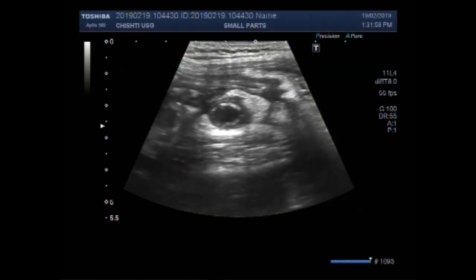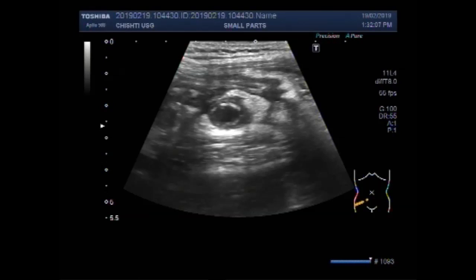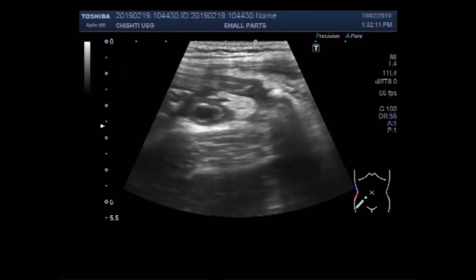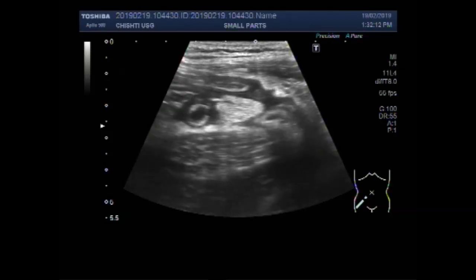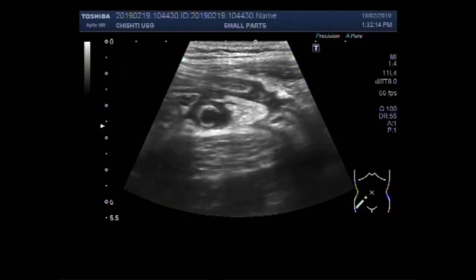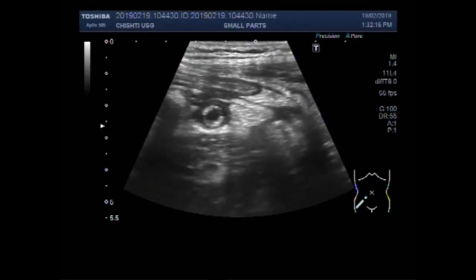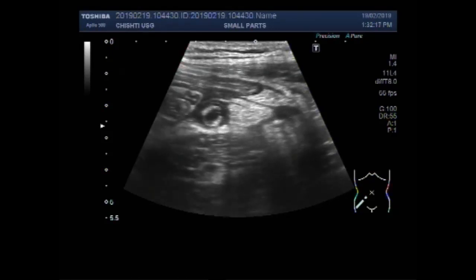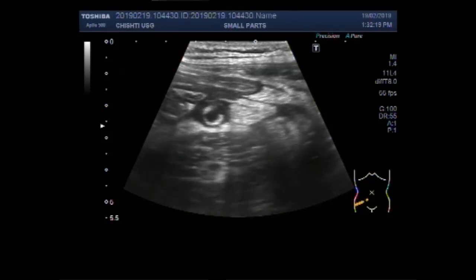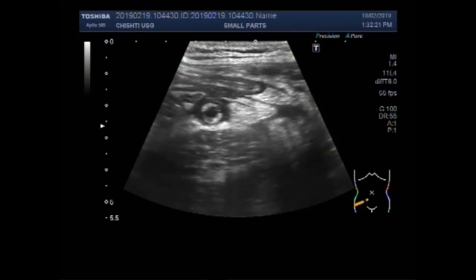This ultrasound video shows a patient having an inflamed appendix. You can see the area, the gut loops and the right iliac fossa. This is the horizontal view of the inflamed appendix. You can see a small amount of inflammatory fluid is seen in the adjacent area of the gut loops.